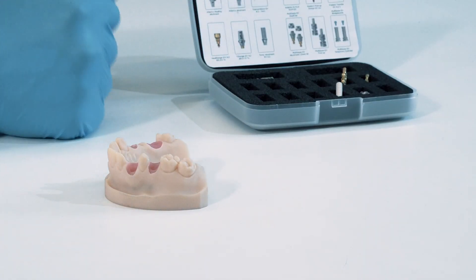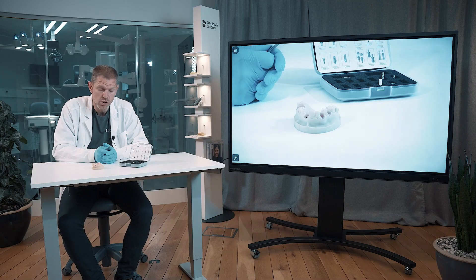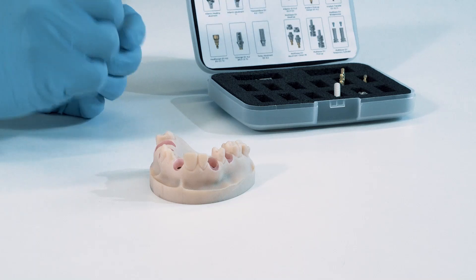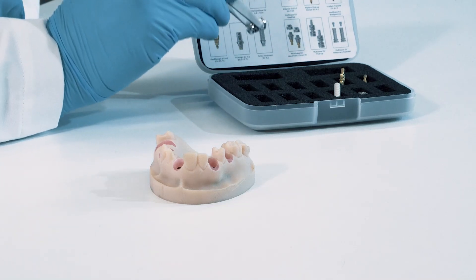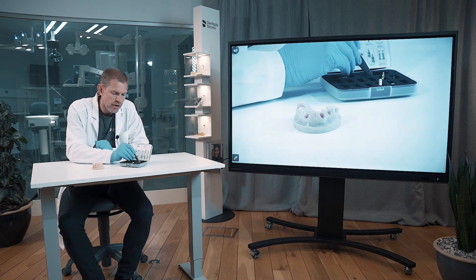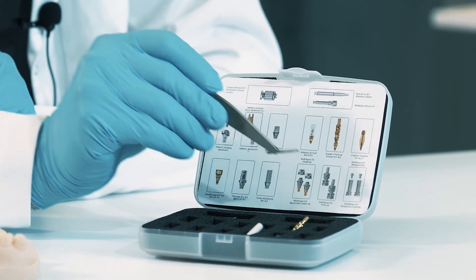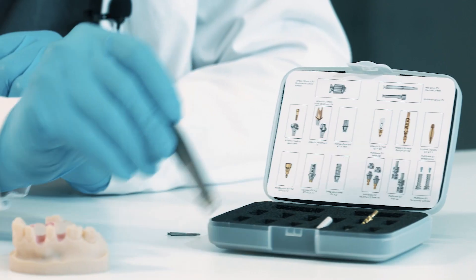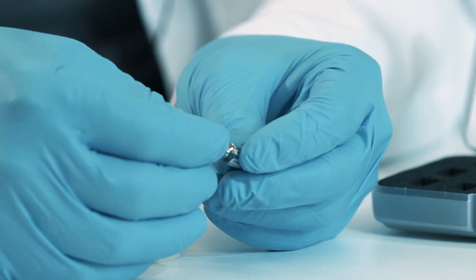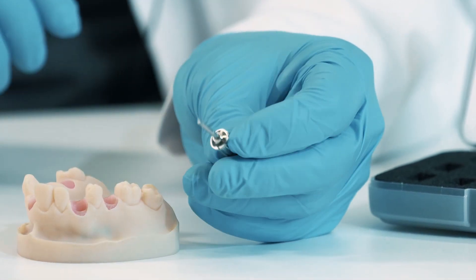We also have this box with a lot of restorative components. To handle the majority of all these products in the box, you need this driver handle that you can see here, as well as the hex driver. I put them together first here.